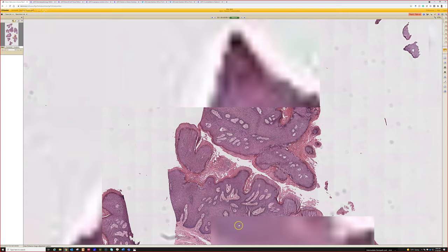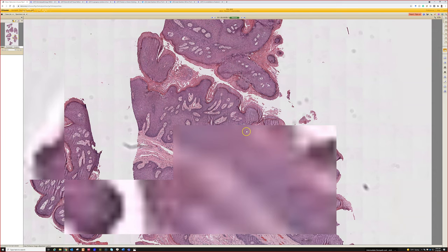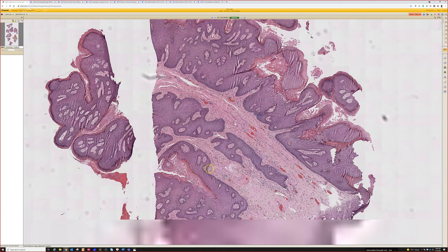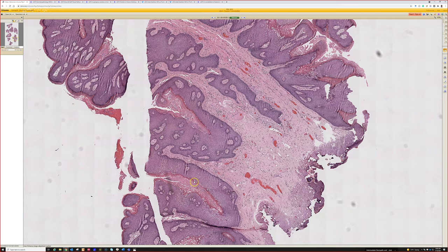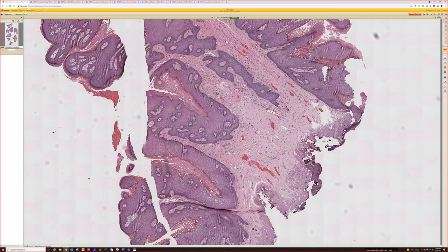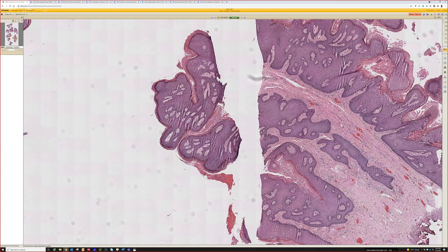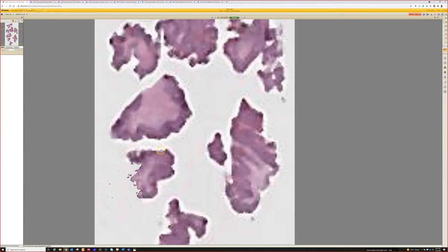If you know the patient already carries a diagnosis of HPV from a past Pap or previous condylomas, that reduces concern about making this diagnosis. If I have doubt, you can use in situ hybridization to look for HPV 6 and 11 and other low-risk types, although that's not perfect. If it's positive, it's very helpful; if negative, it still doesn't rule out condyloma. If I'm unsure, I'll say it's a verrucoid keratosis with some features of condyloma but no obvious HPV, and the differential could include seborrheic keratosis or verruca vulgaris.